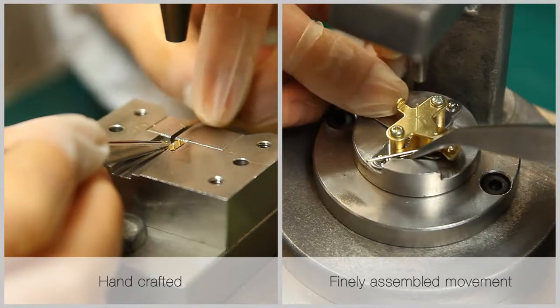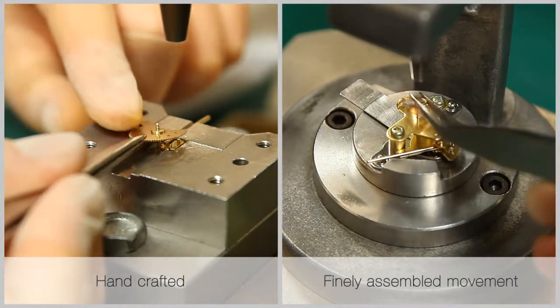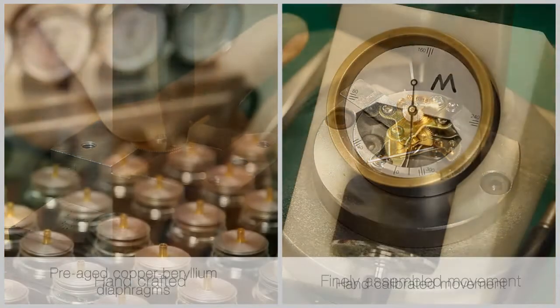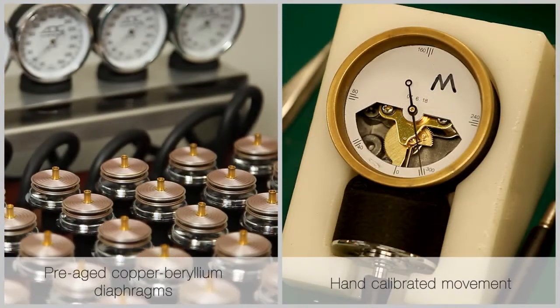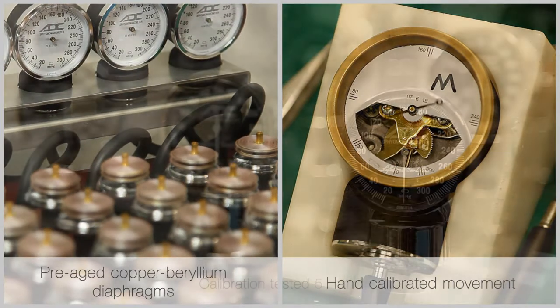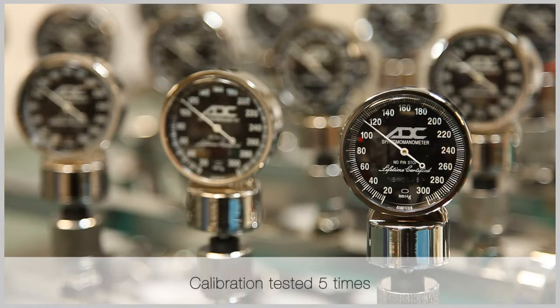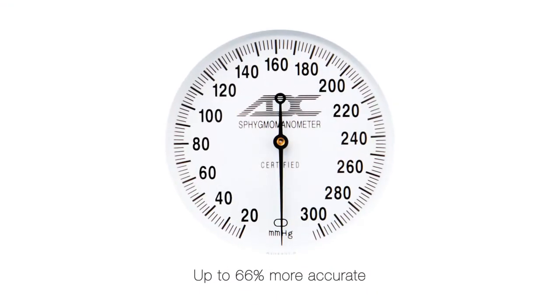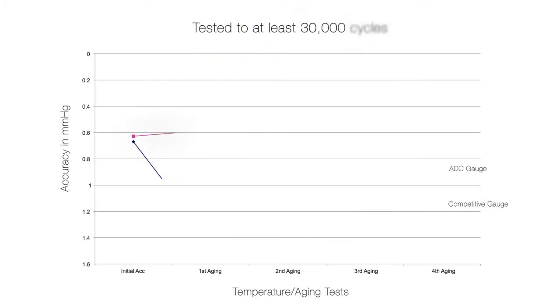ADC manometers were exclusively engineered for us by Nisei, Japan's leading and oldest manufacturer of pressure-sensitive instruments. ADC manometers exceed industry accuracy requirements by up to 66 percent and are built to endure.